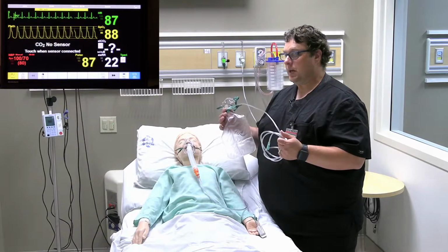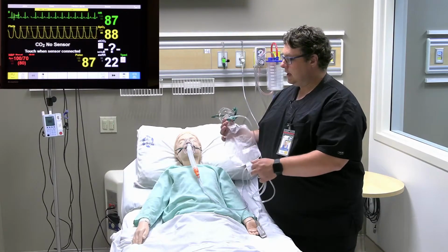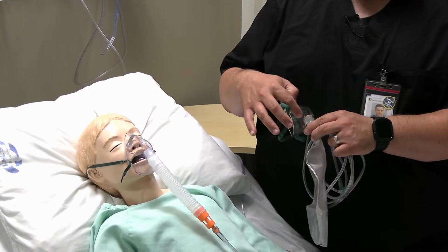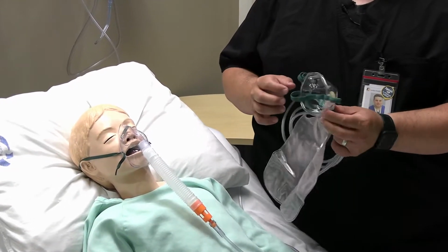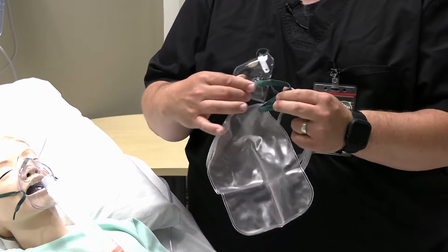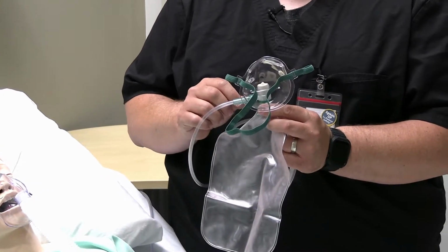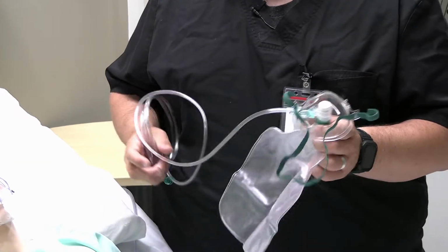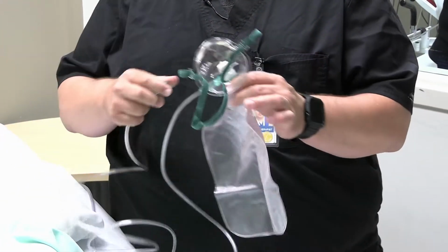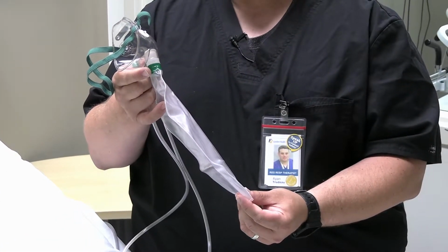So we have chosen the pediatric non-rebreather mask with the reservoir bag and the valve. When you take it out of the bag and assemble it, you want to make sure that you inspect your valves. Again, there should only be one valve on the mask. The other side will not have a valve. And then you have your valve that will open from your reservoir bag when you attach it to your patient.